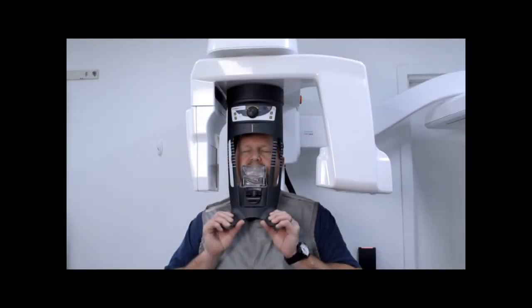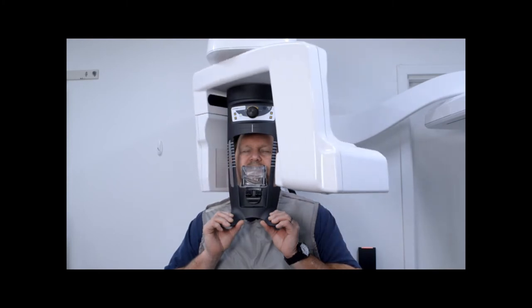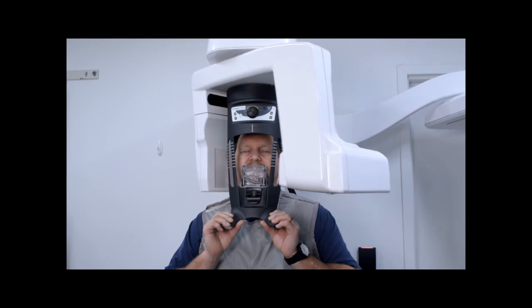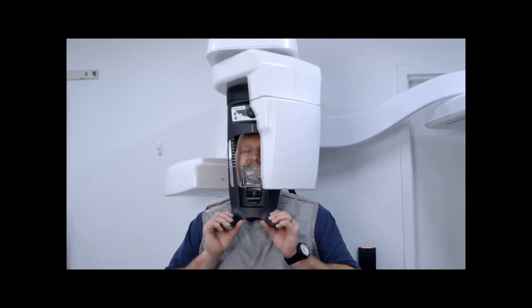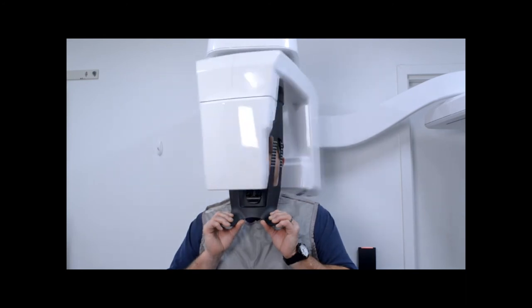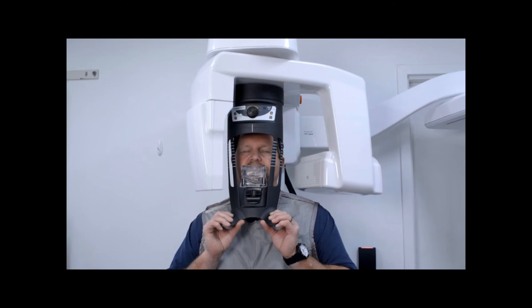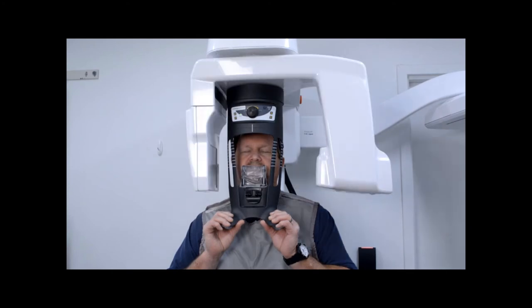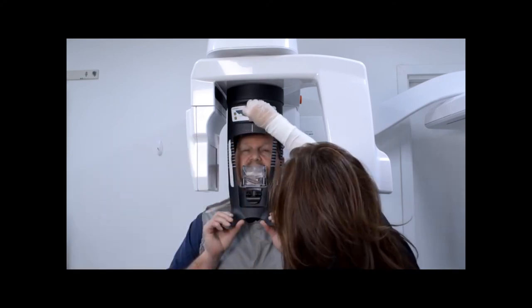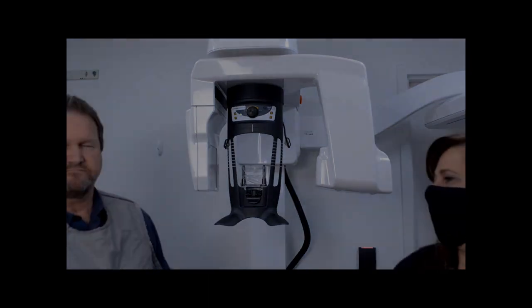Ask the patient to close their eyes, remain still, and breathe through the nose. Instruct the patient not to swallow during the acquisition and to place the tongue on the palate. Exit the room. Maintain visual contact with the patient throughout the duration of the exposure. Launch the x-ray with the remote control. Simply press and hold the exposure button until the end of the acquisition is indicated by the on-screen release hand switch message and a short beep. The x-ray exposure indicator turns yellow and a warning sound is heard during x-ray emission. At the end of the x-ray, return to the room while the volume is being reconstructed. Release the patient and remove the hygiene barrier from the bite block.